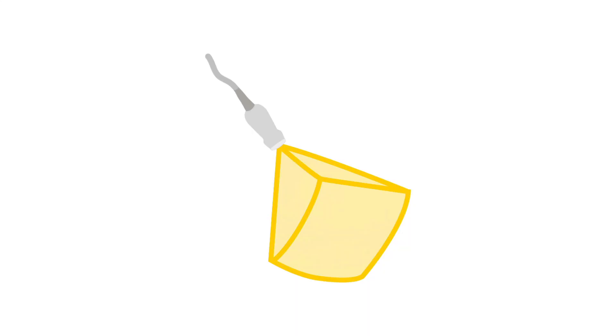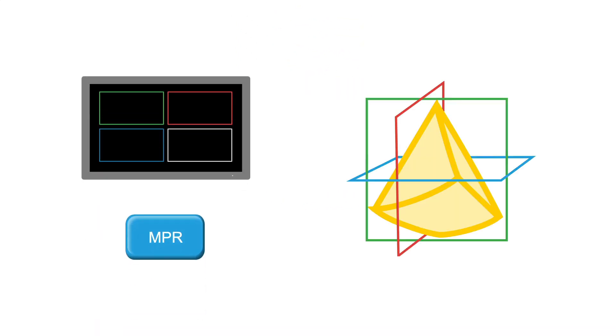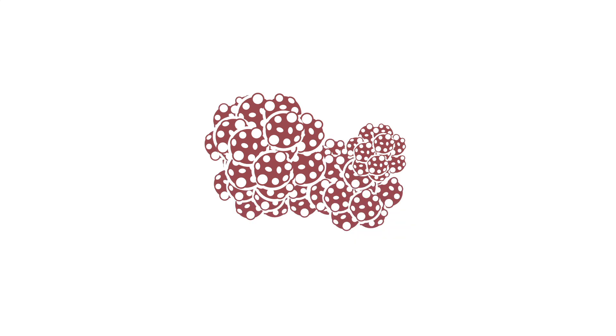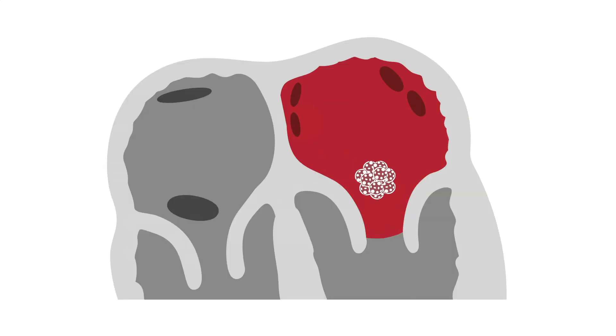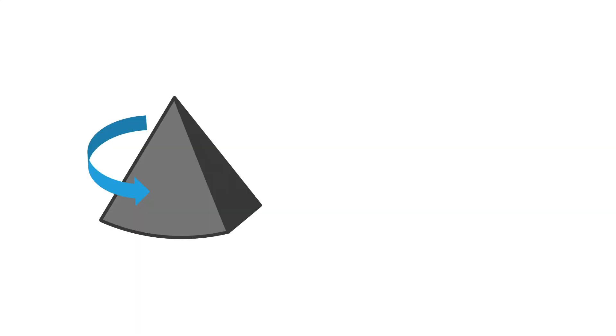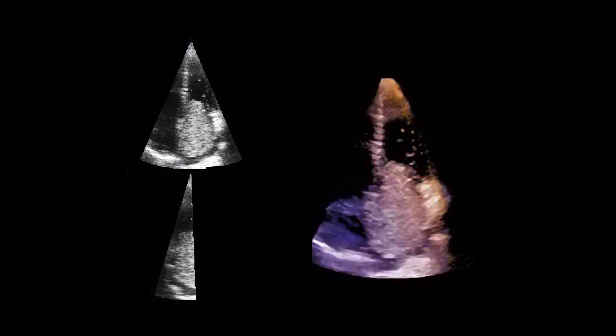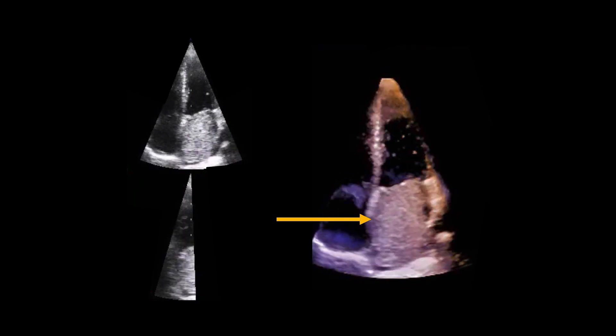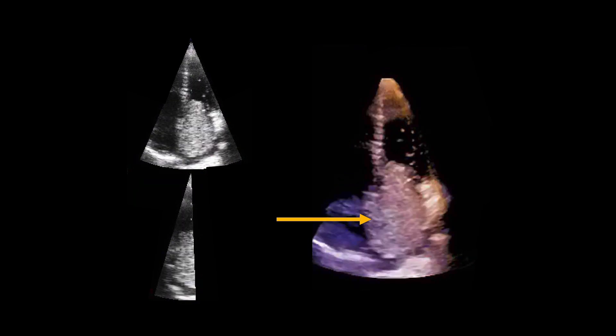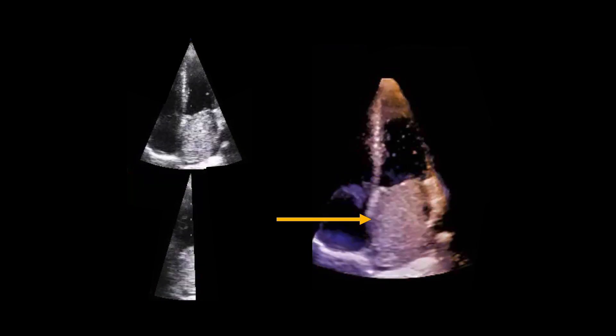3D echo, multiplanar reconstruction and volume rendering allow appreciation of the mass size, shape, and insertion of the septal, inferior, and inferior lateral left atrial walls. Proper rotation and cropping allow the assessment of mass size, shape, and relationship with surrounding structures. On this 3D echo video, you can see septal insertion, which is key in discriminating left atrial myxoma from other masses.